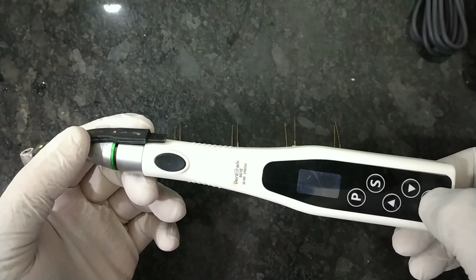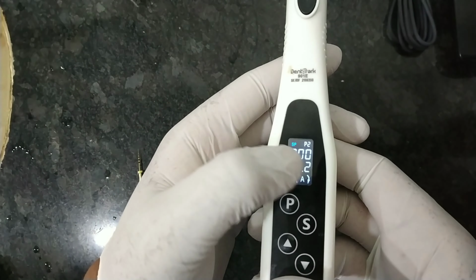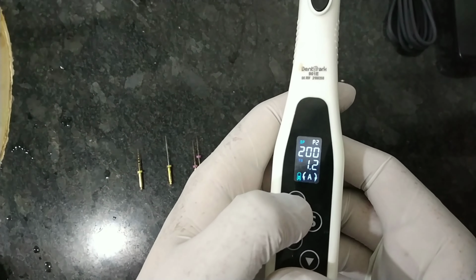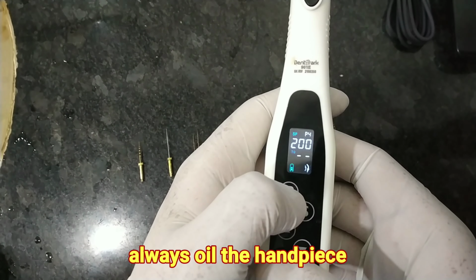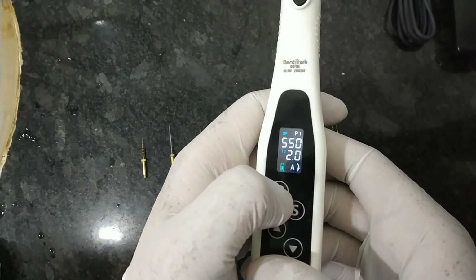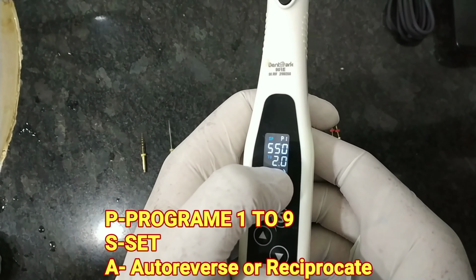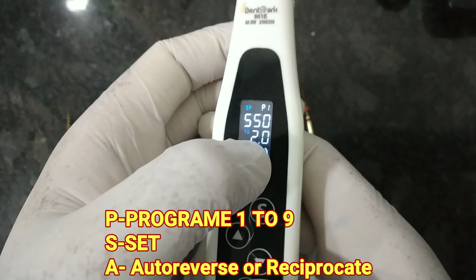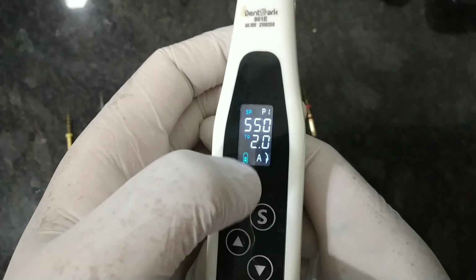And on switch, you can see various numbers like P2. This is program. So there are different programs. First of all, we'll check with that. So P3, P4, P5, and the first number denotes the program. Suppose P1 and the rotation is 550 revolutions per minute and the torque is 2, and this is not in the auto reverse mode. This is just in the forward mode.